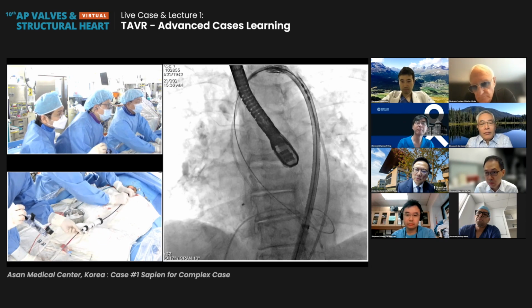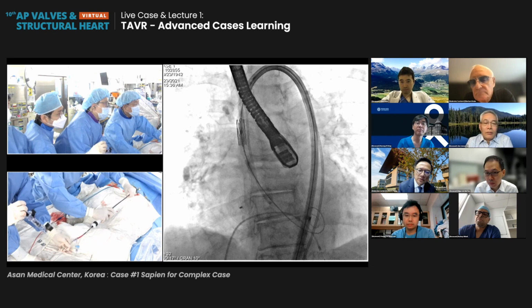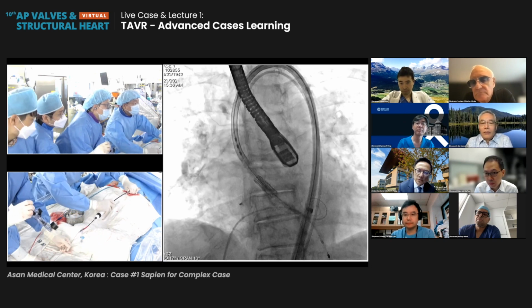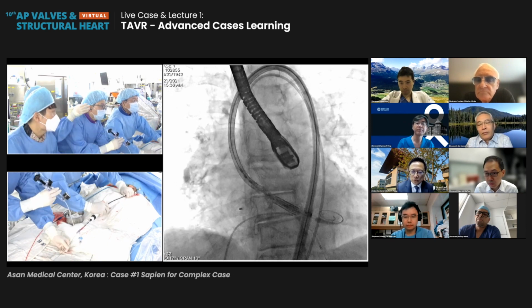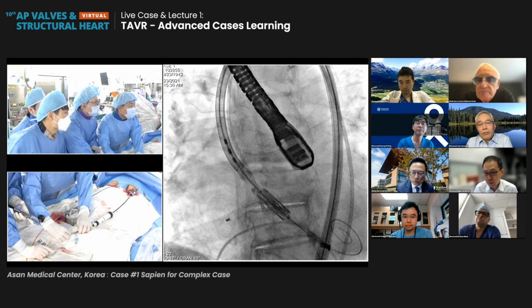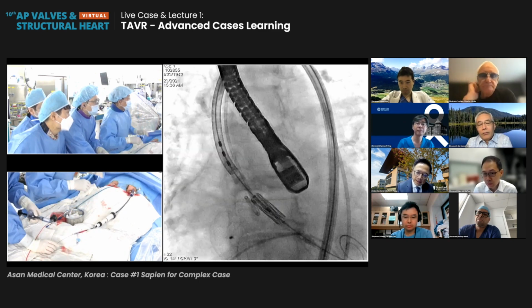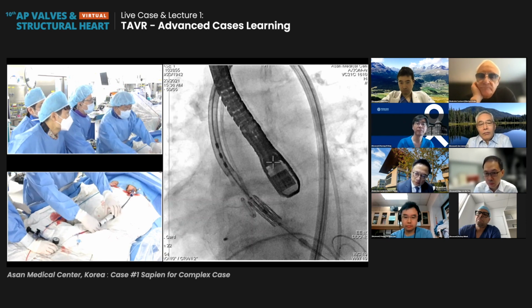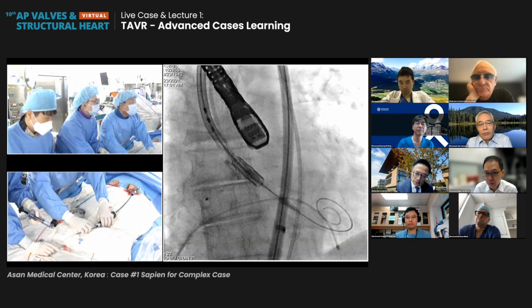All right. Push a little bit behind the device. However, I think it's a very soft valve, and so I didn't hesitate. All right. Contrast, please. Okay. Good. Test.